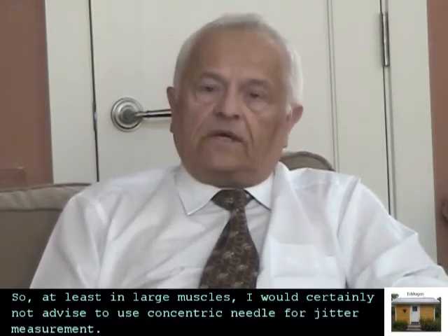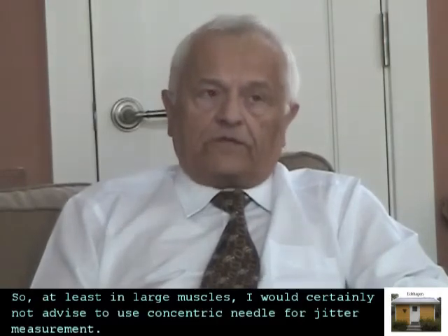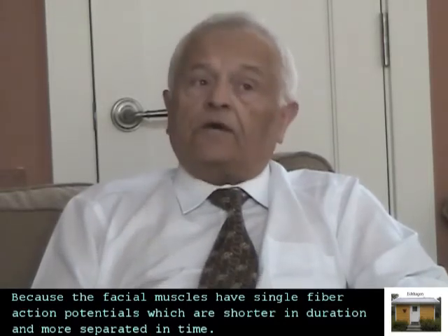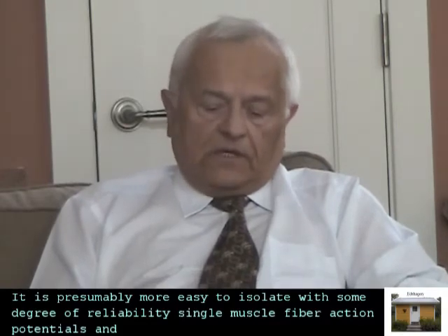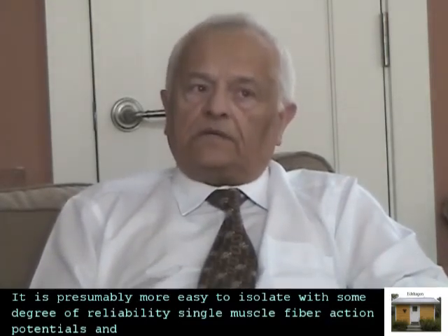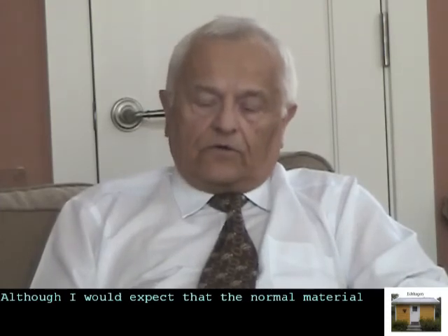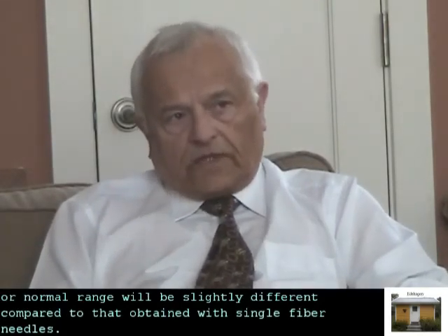So, at least in large muscles, I would certainly not advise to use concentric needle for jitter measurement. Perhaps the situation is slightly different in the face, because the facial muscles have single fiber action potentials which are shorter in duration and more separated in time. So it is presumably easier to isolate, with some degree of reliability, single muscle fiber action potentials and make measurements which are satisfactory. Although I would expect that the normal material or normal range would be slightly different compared to that obtained with single fiber needles.